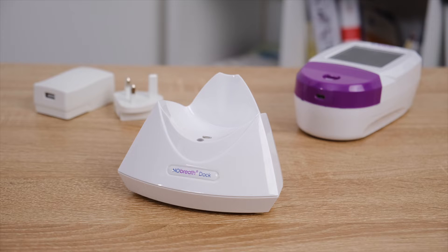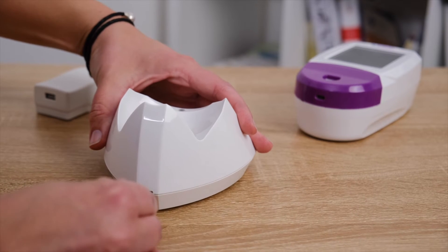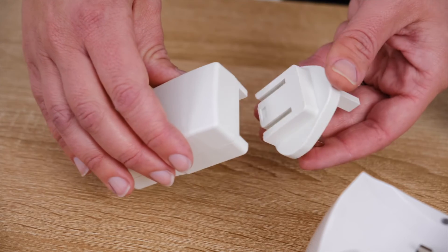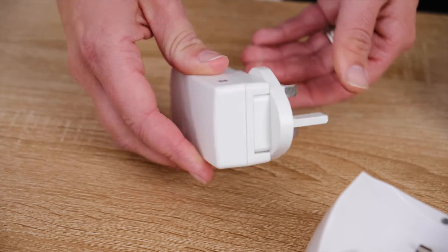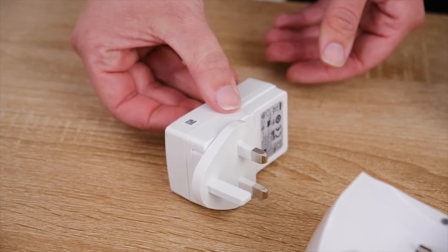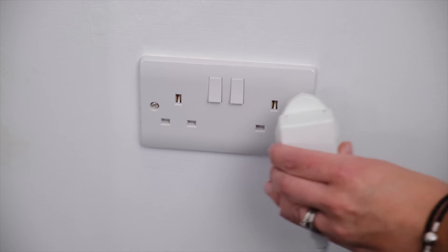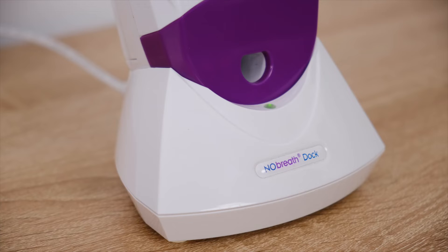The No-Breath Pheno monitor comes with a No-Breath dock and charging cable to keep the monitor at hand and fully charged. To charge the No-Breath, first make sure the micro USB cable provided is connected to the No-Breath dock. Assemble the mains adapter using the appropriate universal adapter, then connect the other end of the micro USB cable to it before plugging into the mains power. When receiving power, the LED on the No-Breath dock will light up green and the monitor can be placed in the dock to charge.